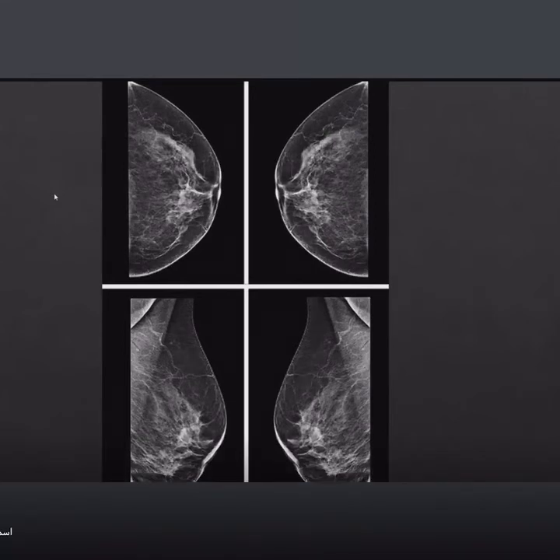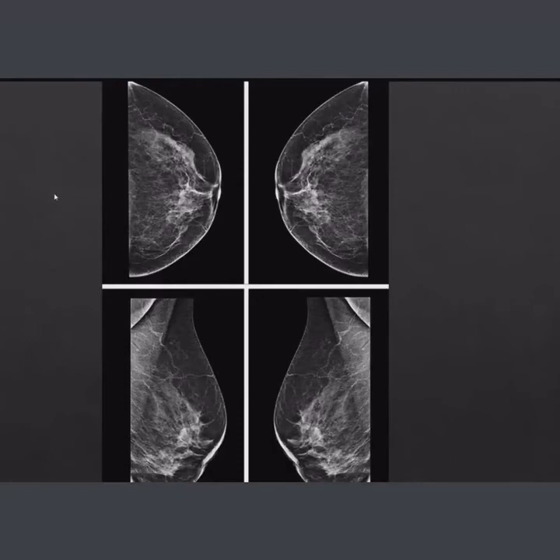Breast imaging. The modalities used in the assessment of breast imaging are ultrasound, mammography, and MRI. Our things are going in reverse. We should start with mammography and further analyze by ultrasound, since we are speaking about breast carcinoma. As you know, breast carcinoma usually has a certain age, from about 45 to the 60s, then 65 to 70, and beyond the 70s its incidence starts to decrease.